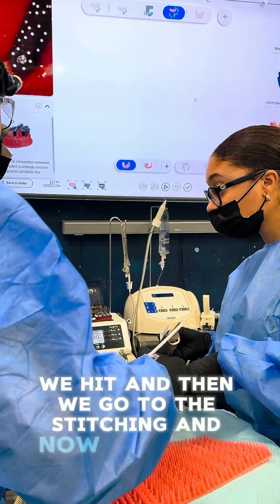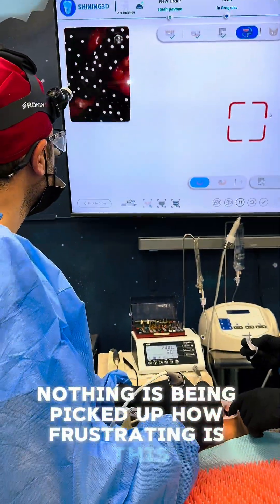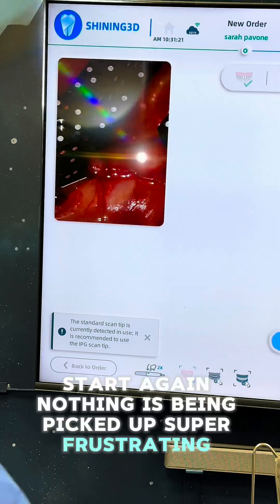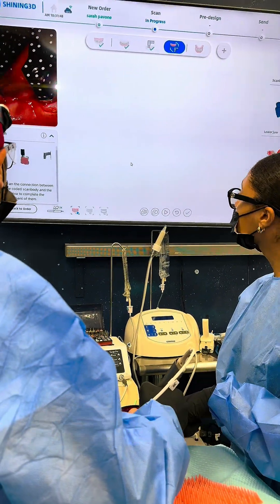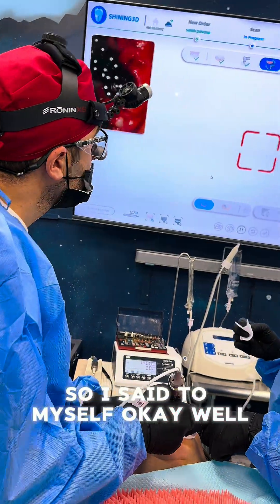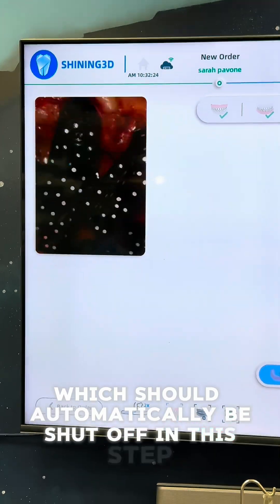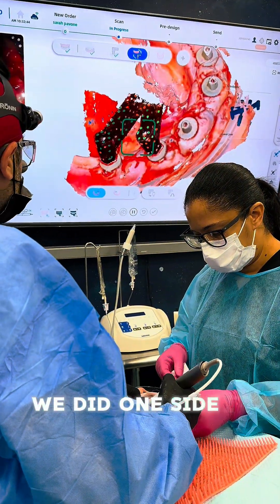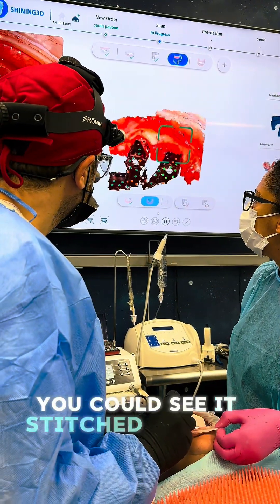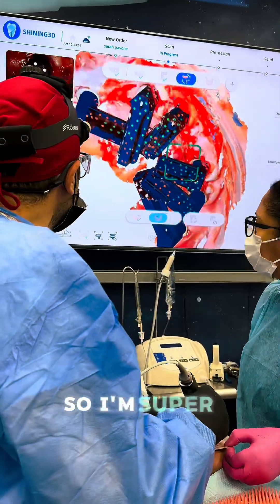Everything looks great - we go to the stitching and now I place the scanner. You can see on screen nothing is being picked up - how frustrating. Go back, start again, nothing is being picked up. Super frustrating again, nothing. I figured out I needed to shut off the AI scan, which should automatically be shut off in this step, and it turned on. We did one side and it stitched right away. The other side stitched a little bit wrong but as we continued scanning it fixed itself.